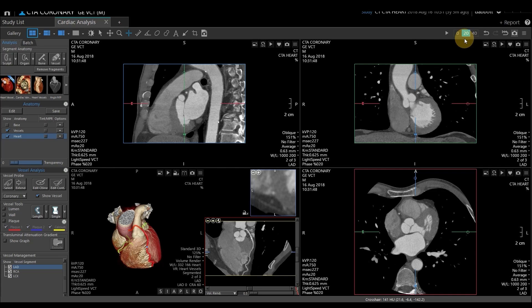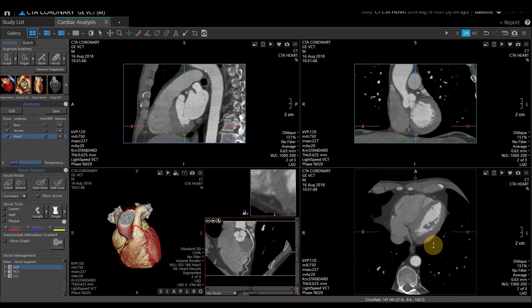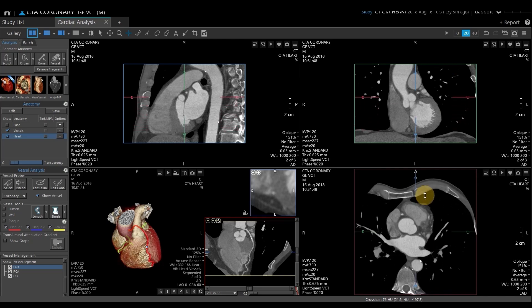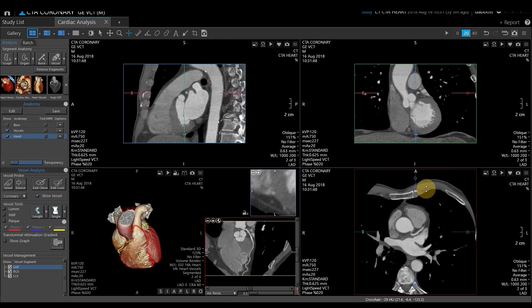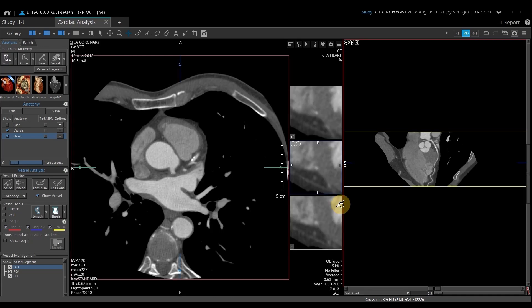The next thing I want to do is start looking through my axial image just to get kind of an overview, and then I want to start doing vessel analysis. You can go full screen on any viewport — I'm going to double-click on my axial to go full screen.